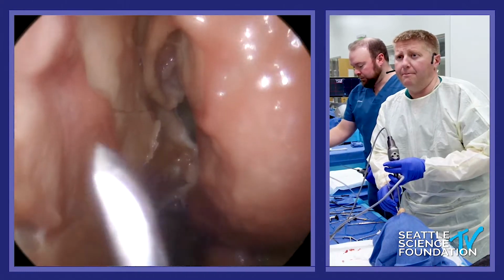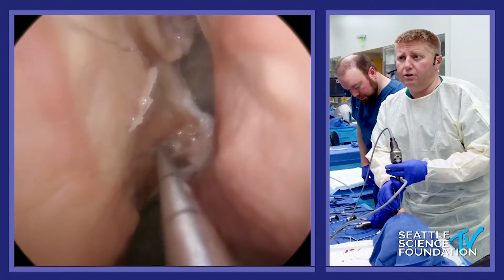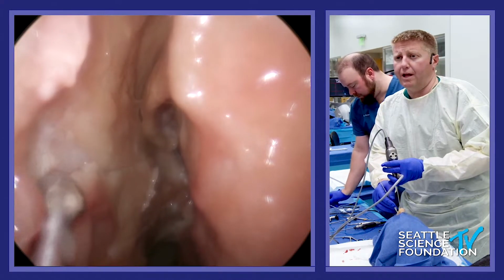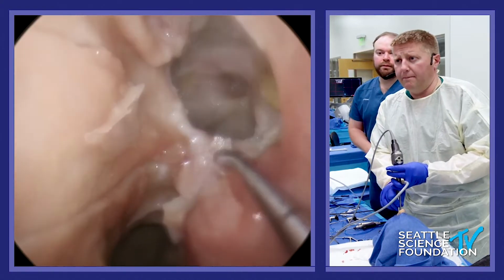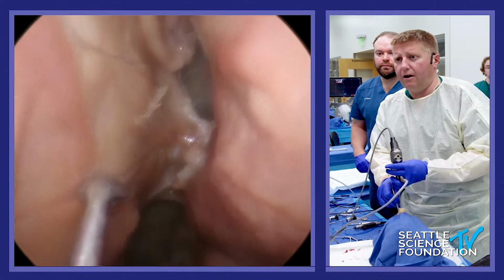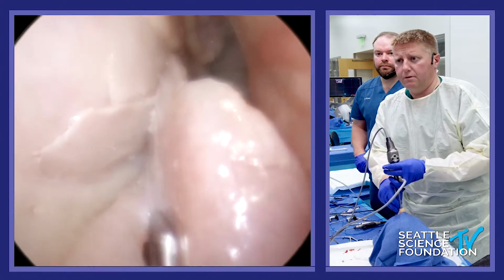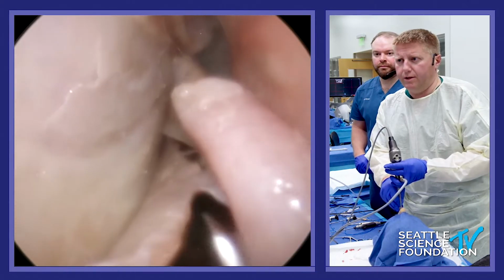Now, admittedly, I made a cut here earlier, in the interest of time, and I made it a little bit smaller than I would because Dr. Woodworth is going to be showing a drill out procedure and wanted to use some of the mucosa up here. So I made my superior cut here, my inferior cut here, carry it onto the nasal septum, and then it's a septoplasty. And you just raise it up, and you can see where some of the cut almost went through, but not quite.